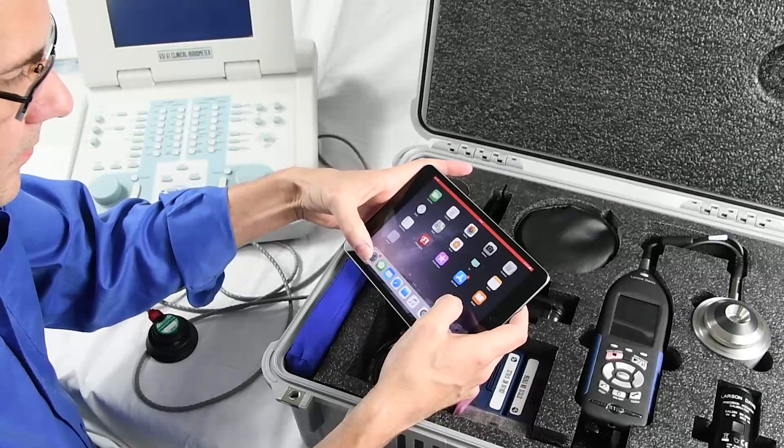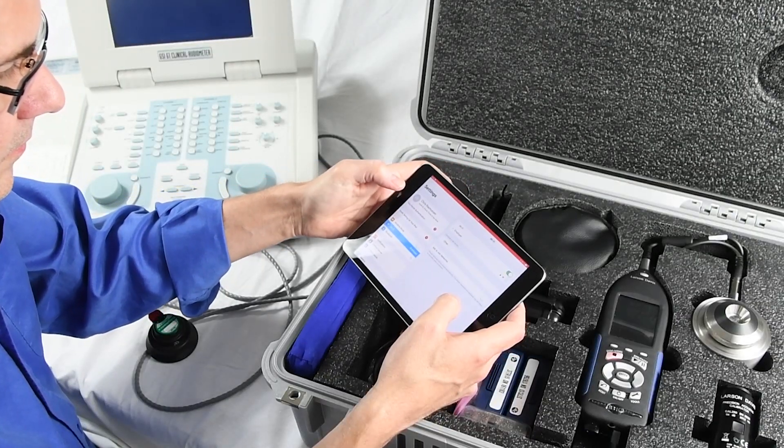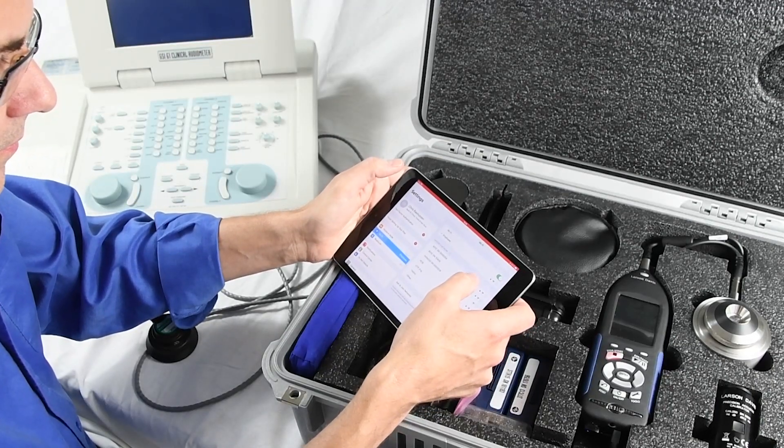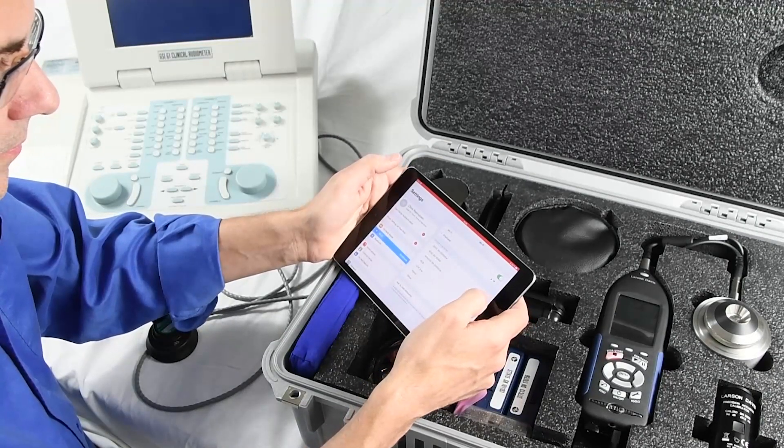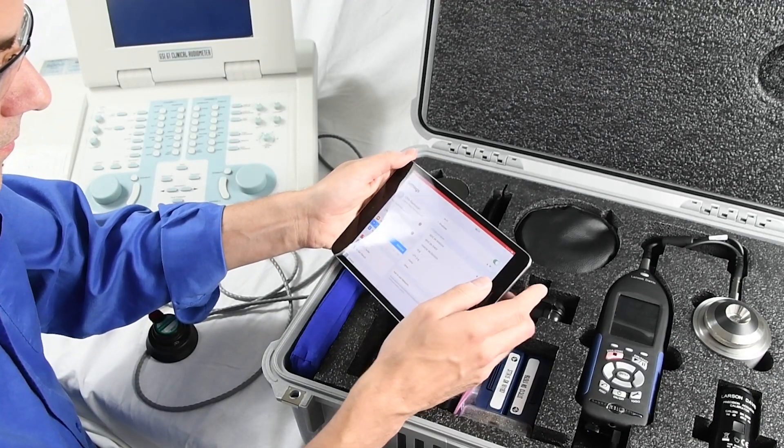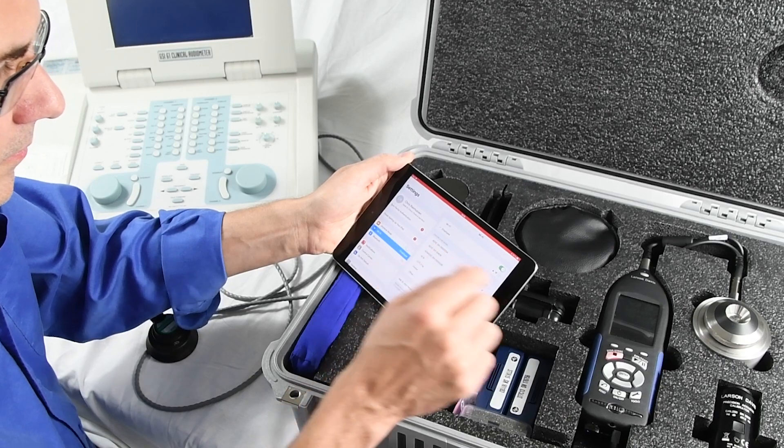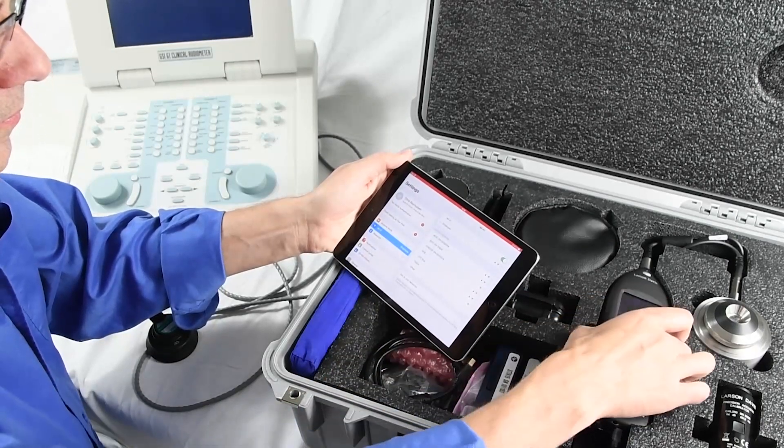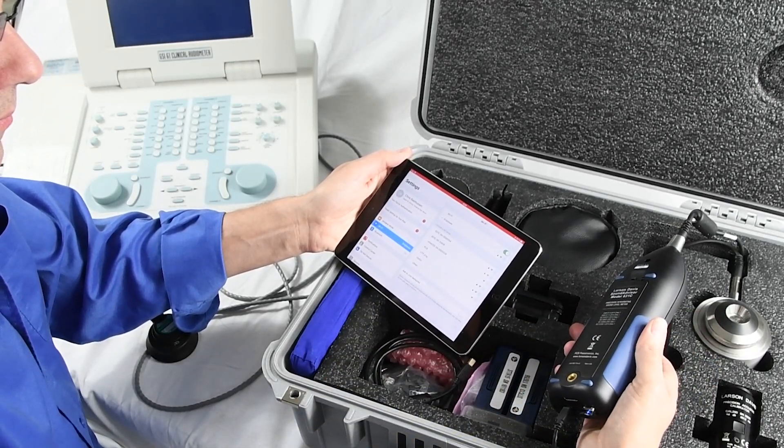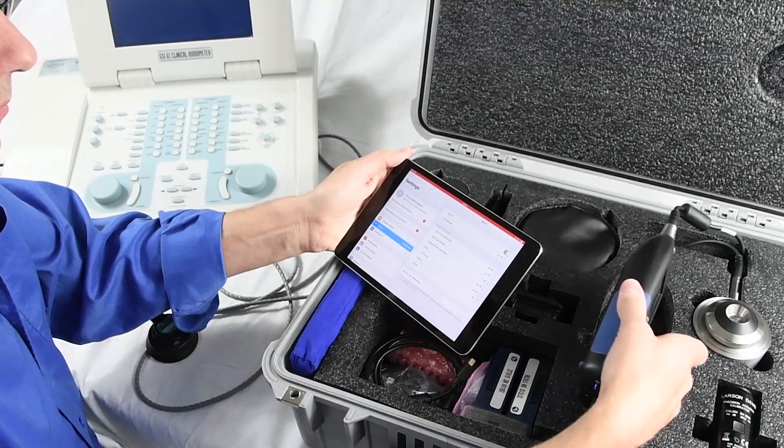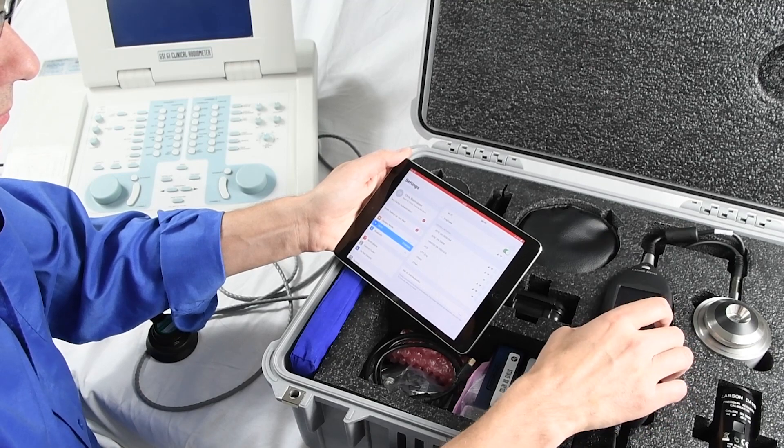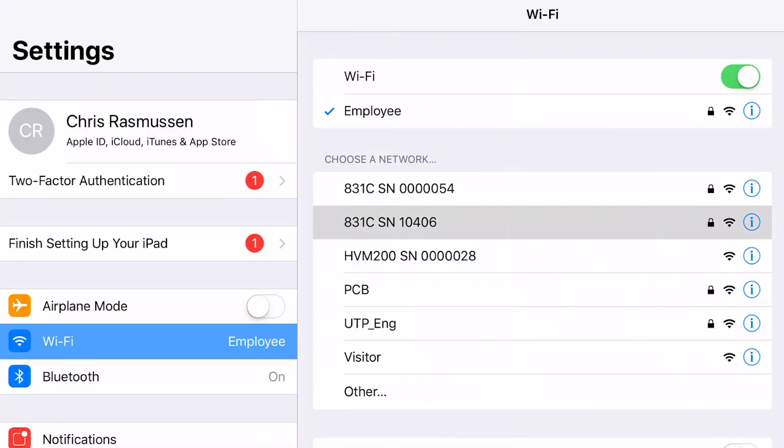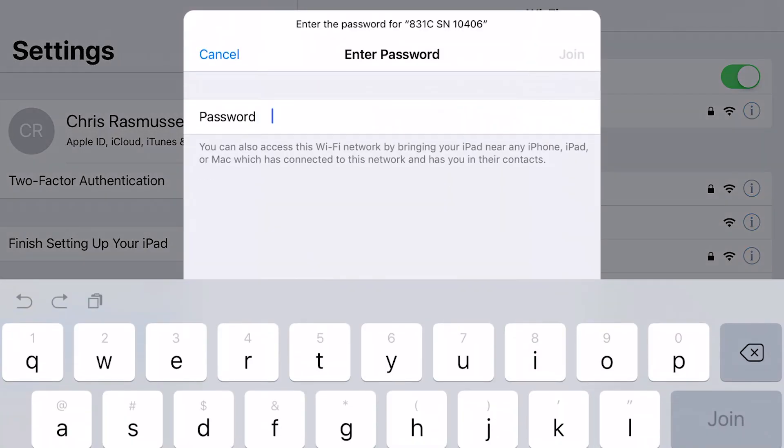Now, on your tablet, Android or Apple, open up your settings and go to Wi-Fi. The meter will be a hotspot, and the name will be 831c followed by the serial number, which can be found on the back of the meter. Match the name and the number, then connect.